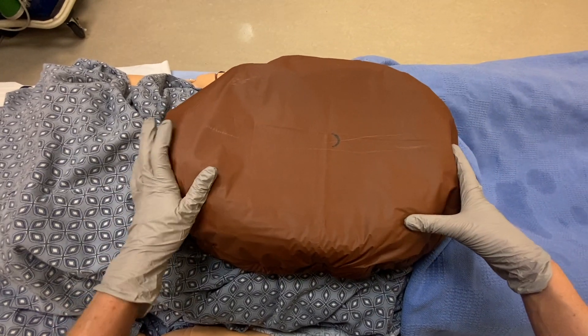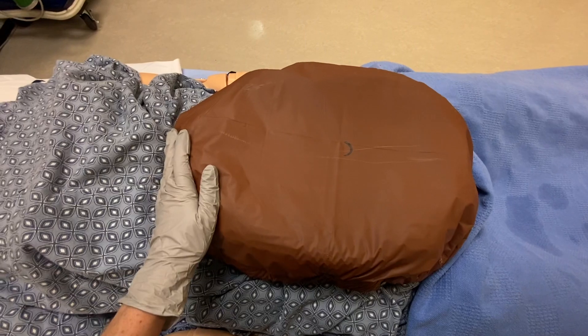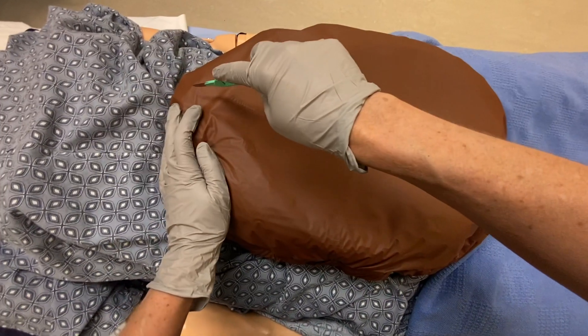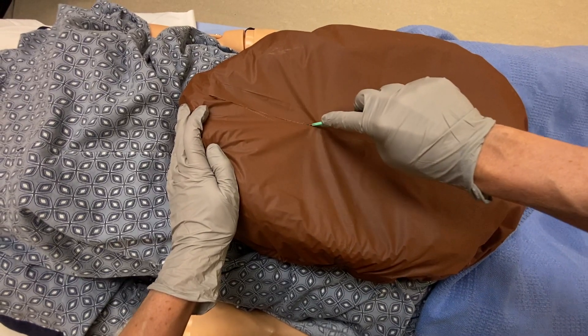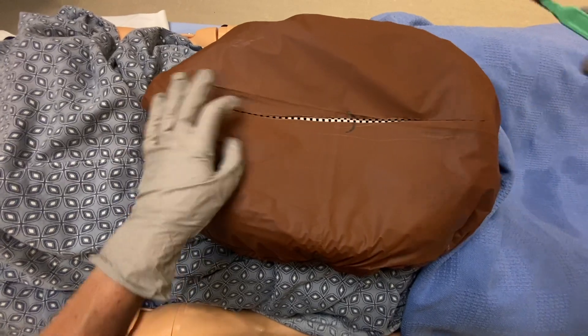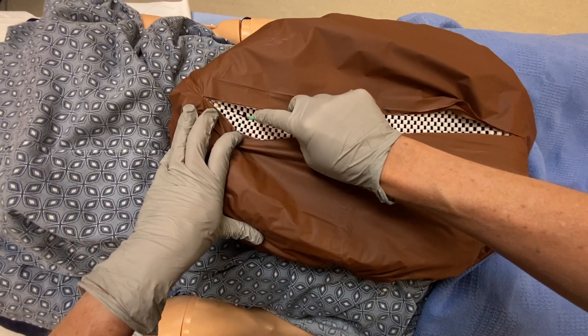So for a perimortem C-section, you're going to feel the xiphoid process, and you're going to make a long vertical incision from the xiphoid process to the pubic symphysis. I'm going to cut through — and we're through the skin. Now we're here at the peritoneum. I'm going to cut through that as well.